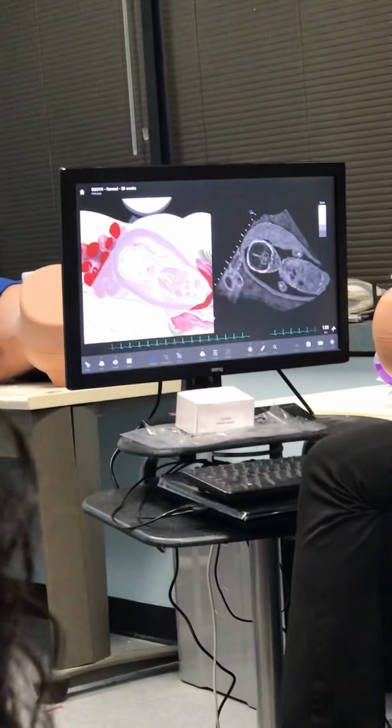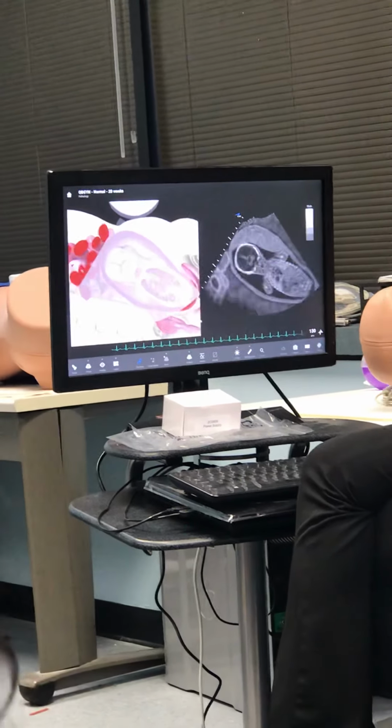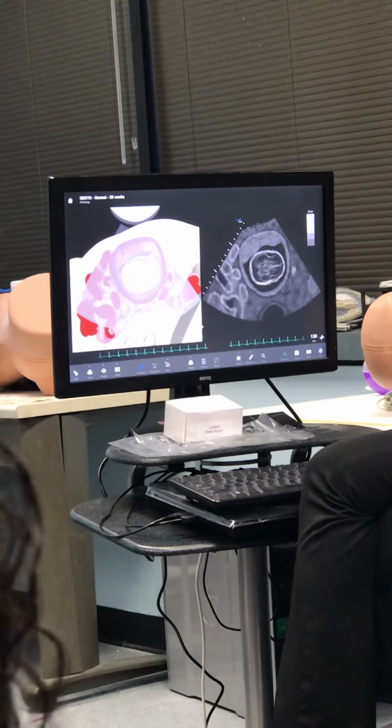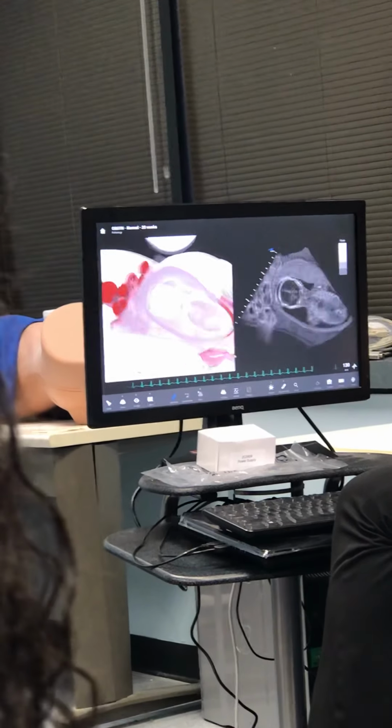We'll talk about grades of the placenta. This one is perfect, so he would technically be grade 0 or 1. There are more interesting options though. And then for the head, do we have enough space to do that?